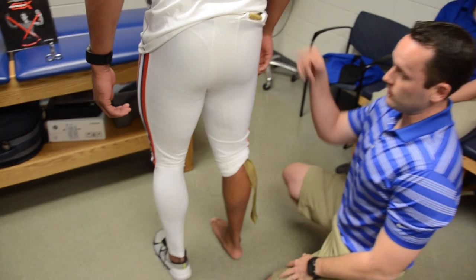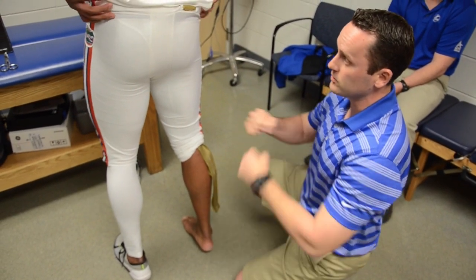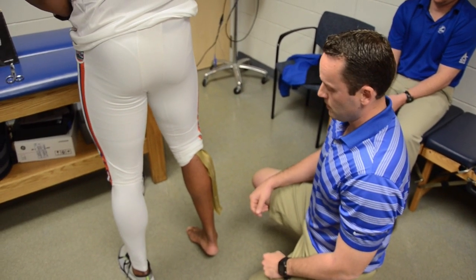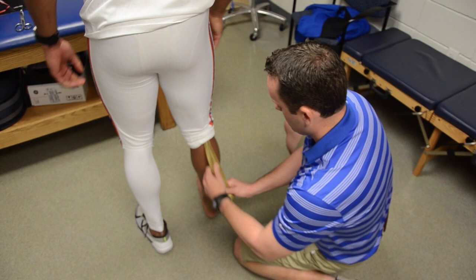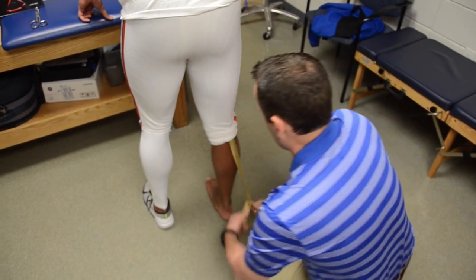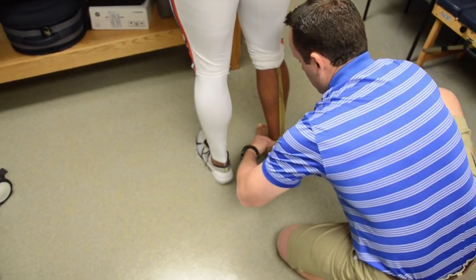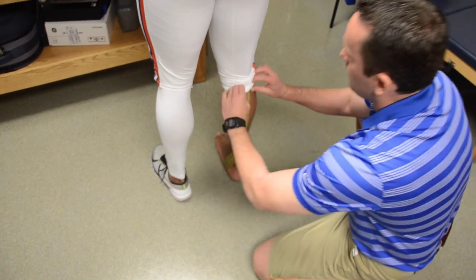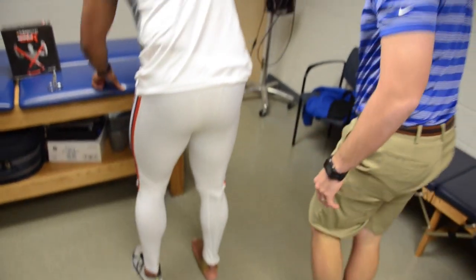Now before I pull it tight, I want him to tighten the pants up real tight, because it's actually going to want to pull these pants down a little bit. So he's going to have to secure his belt as tight as he can go with it. Once he has that fit, we'll go ahead and lift your heel up off the ground. We'll secure this underneath his heel — and you can have the socks on as well, that's fine. Then secure it over there. Pull his tights down and seal it. Slide his shoe back on now.